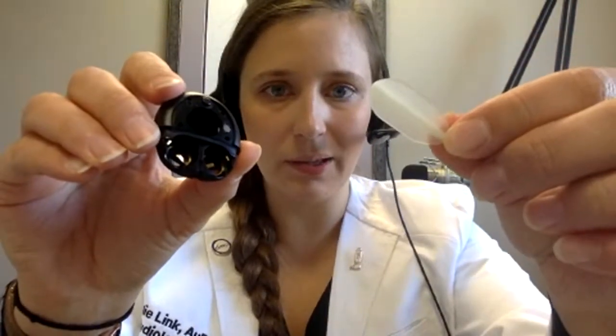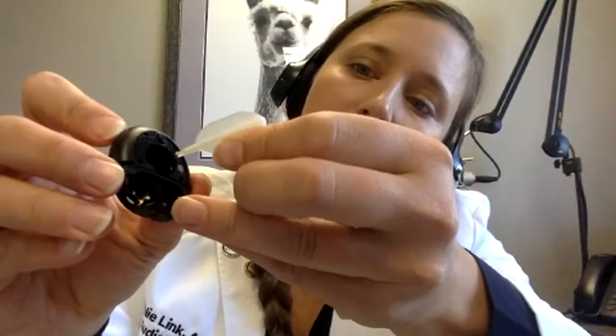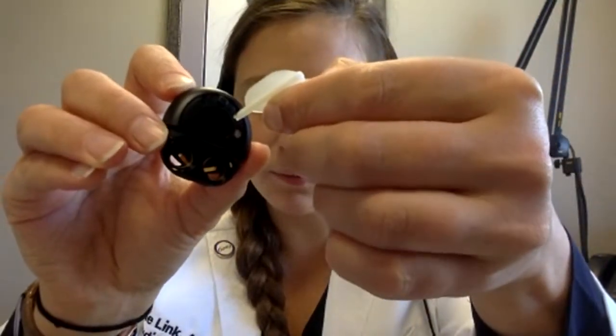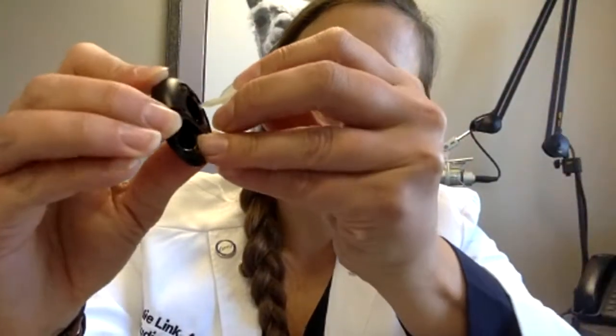So in your implant supplies, you're going to have a little tool that's going to look like this. You're going to take that tool. Let's see here. We're going to line it up with that filter, push it down. Oops, hard to do without looking at it. Right, and that's going to pull that filter off. So it's pretty cool. You're going to do that for both sides. And then inside your packet, you'll have something that looks like this. This is going to be some replacement mic filters. Notice that roundness, it's the same size, which is pretty cool.